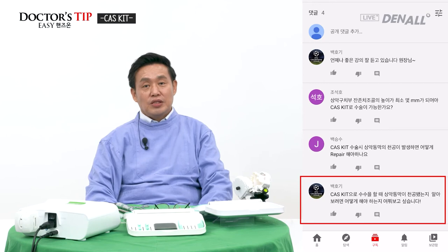is a blind method. When you use a conventional osteotome, and if you feel the sinus membrane is perforated, you can stop the procedure, then it's okay. But the problem is when the membrane is actually perforated, but you proceed with the procedure thinking it is not perforated based on the Valsalva maneuver or other techniques.